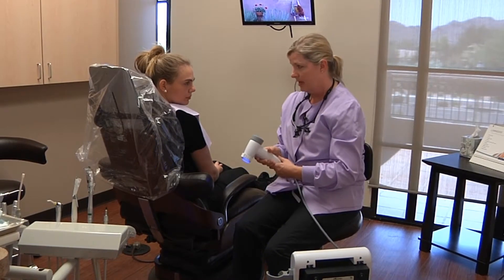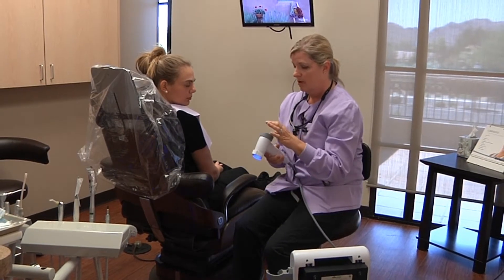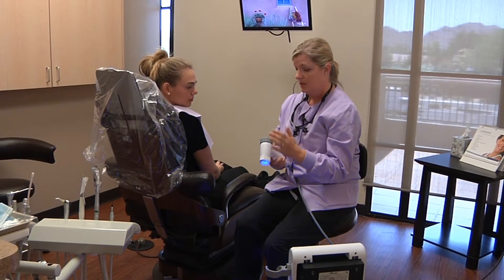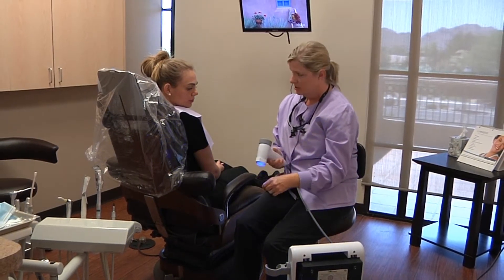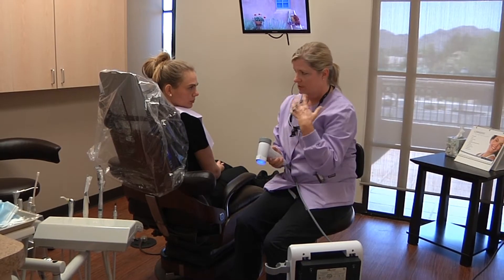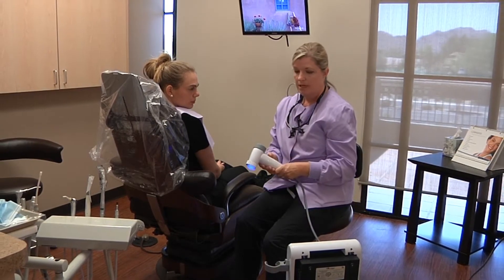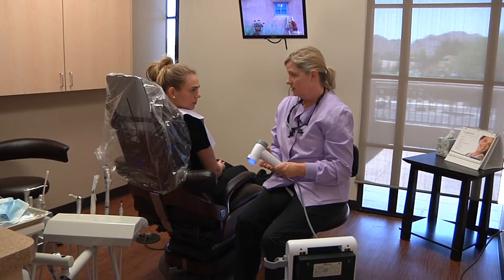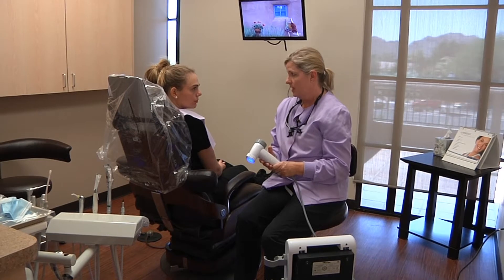As it reflects back at us, we're viewing all the tissue through a scope that's much like a night vision goggle. As we're looking at your tissue in your mouth and the back of your throat and your lips and your cheeks, we'll be able to give you an idea if there's anything that looks suspicious to us for oral cancer.